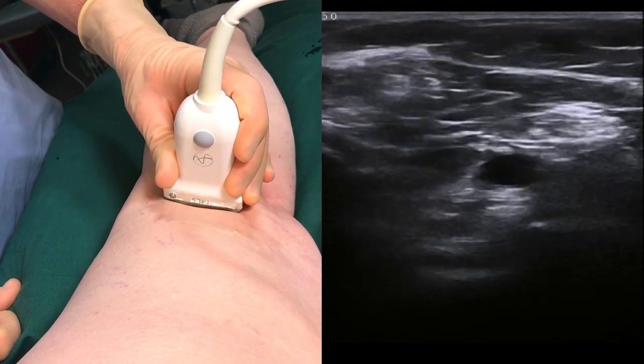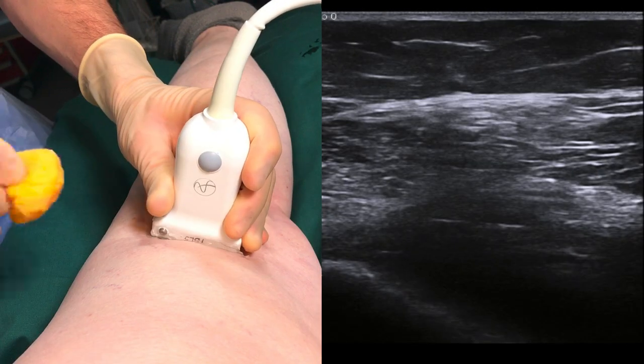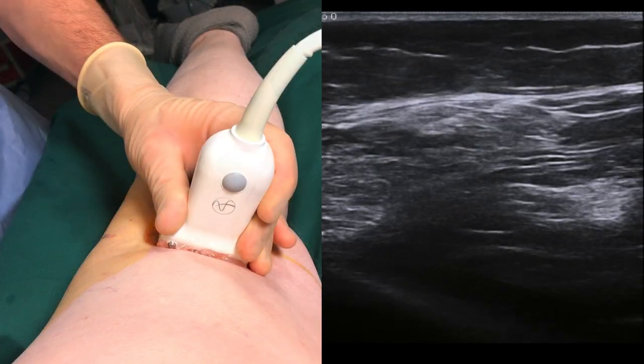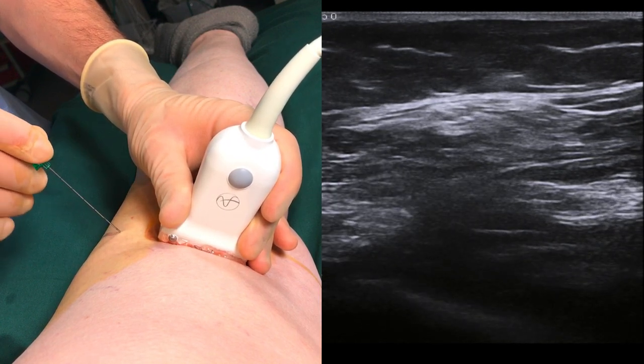An additional quick scan confirms that we have located the bifurcation of the sciatic nerve. Prep the area with an antiseptic solution. Insert the needle a couple of centimetres away from the edge of the probe and inject a small amount of local anaesthetic just under the skin.